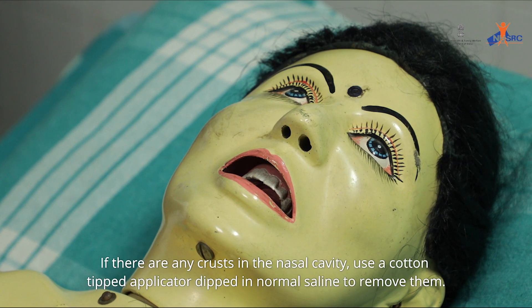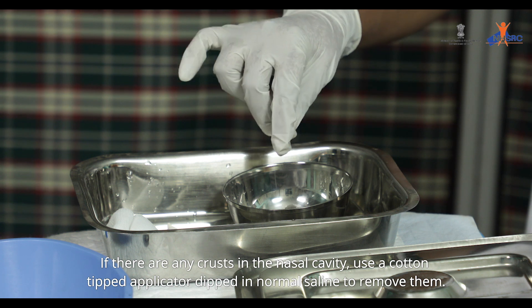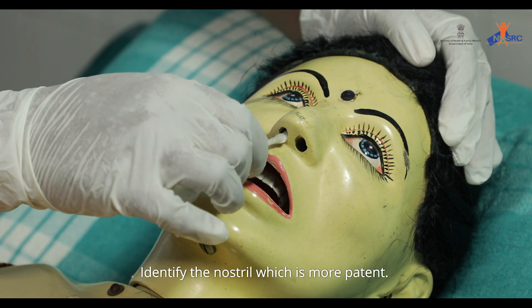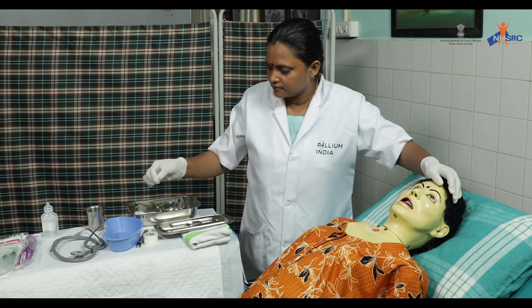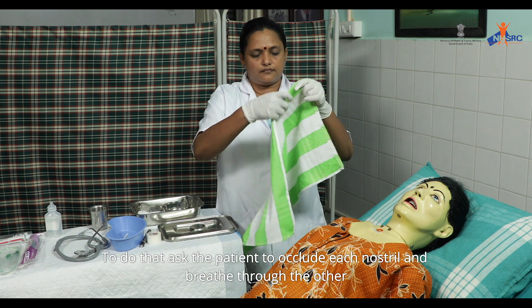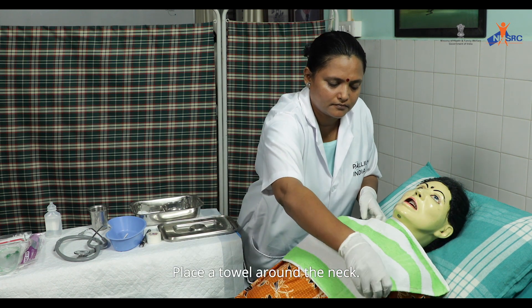Wash hands and wear clean gloves. If there are any crusts in the nasal cavity, use a cotton-tipped applicator dipped in normal saline to remove them. Identify the more patent nostril by asking the patient to occlude each nostril and breathe through the other. Place a towel around the neck.